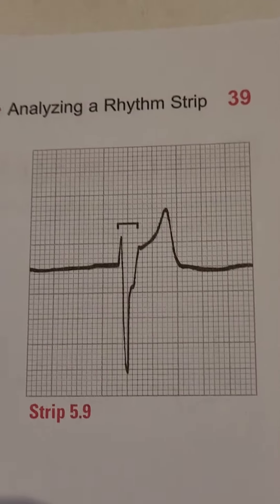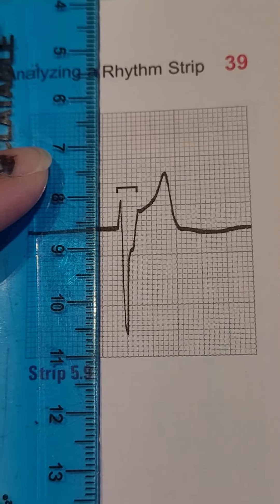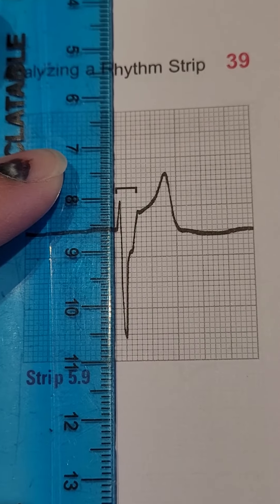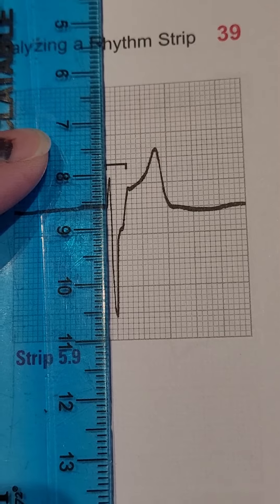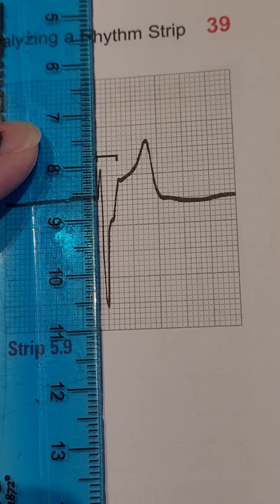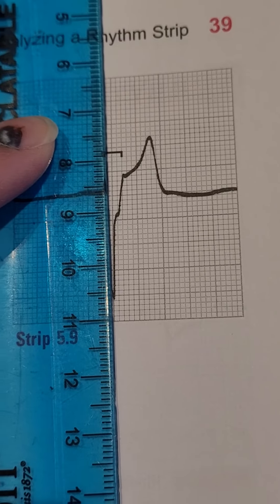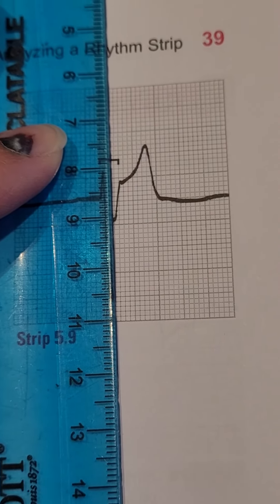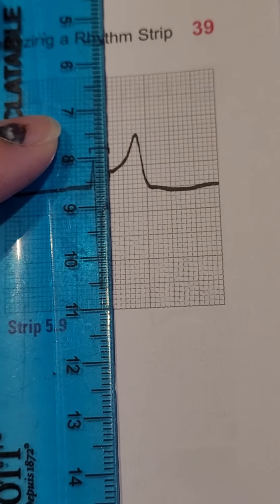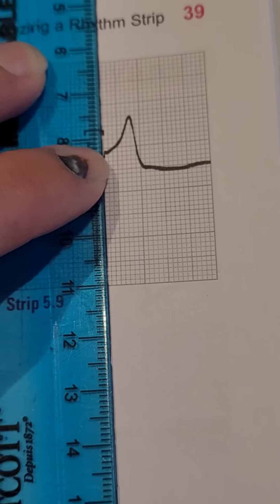Now I'm going to change my ruler to have a vertical edge. And you can see as I go along here, you see the first positive deflection — that's the beginning of your QRS complex right here. And then there's a downward negative deflection here, and a bit of a notch, but it continues to go up. And that's your J point right here.